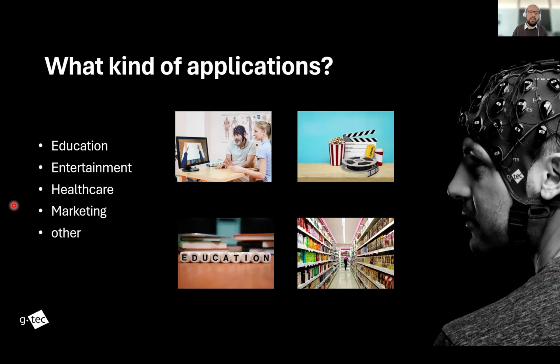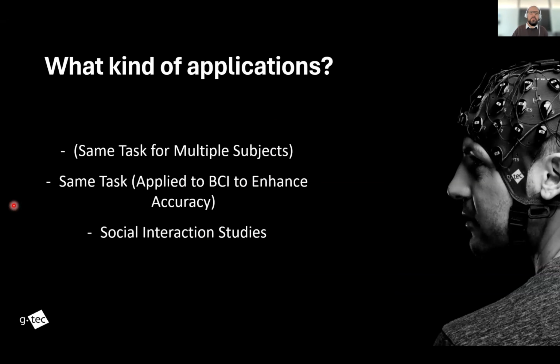You also have the case of healthcare and marketing, where you want to know what the reaction of people is to a kind of product, etc. So the kind of applications typically are comprised of multiple subjects with EEG caps on the head, who typically are performing the same kind of task. This is something that we will be seeing here today, and this is something that is very common in this kind of application.